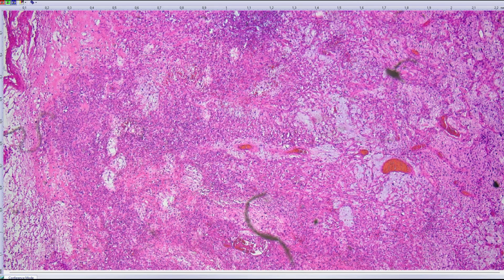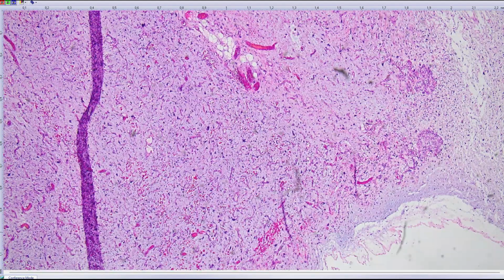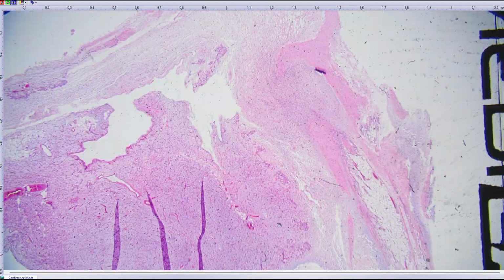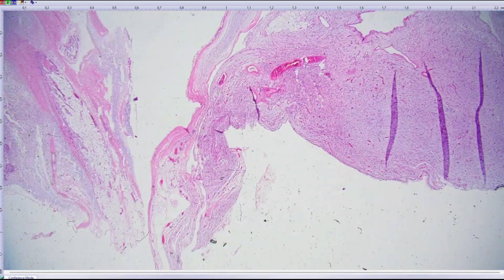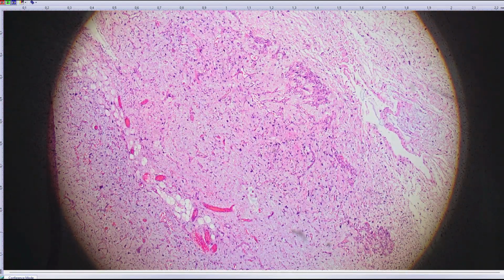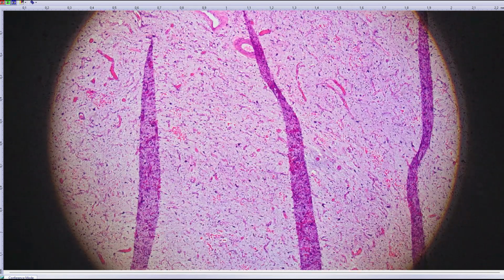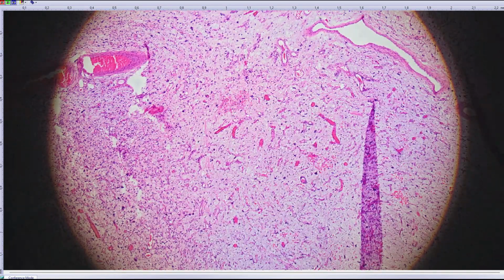We have a few cases, mostly soft tissues. The first one is an 82-year-old gentleman with a tumor on his thigh. I'll start with this slide. Scanning magnification. So all you can see is a myxoid soft tissue lesion. On higher magnification, you can already see that this is something obviously pleomorphic, something that has prominent vasculature.